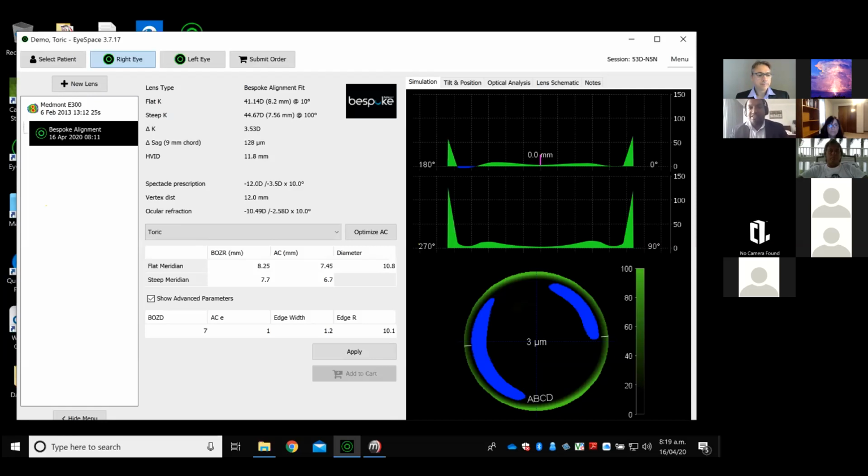There's another question there about the Zeiss Eye Profiler and its Atlas software, and does iSpace work with that? Well, the answer is pretty simple. It will work with most topographers, and the way that we use it when, say for example, we've reached out to Zeiss and Atlas, and we're still waiting to hear back from them because we've had users requesting this functionality. We can actually create a reference map using their data, and then we can design off that.